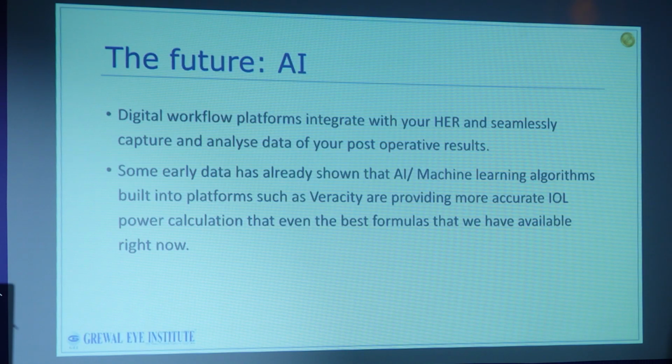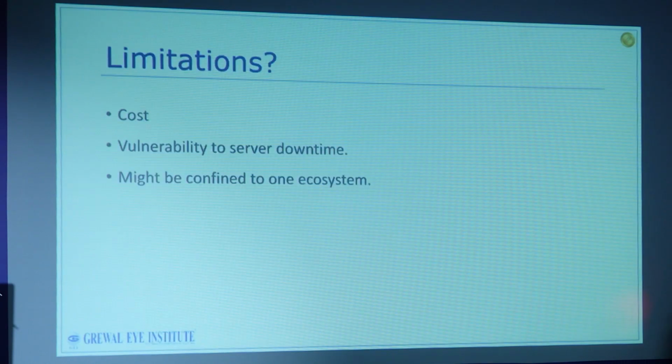That is the advantage of something which captures data end to end. That it is capturing data seamlessly. It is able to utilize that data, so it's not dependent on you uploading that data. Some of the limitations that will be there obviously are cost, but again, since it's cataract surgery, the economies of scale kick in because you'll do a lot of these, so you will end up using this quite a bit.